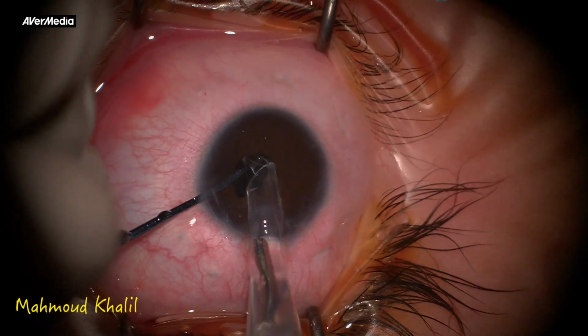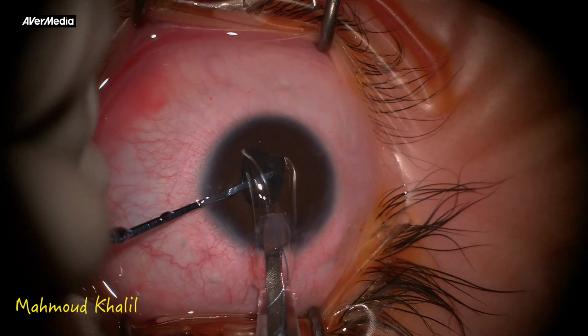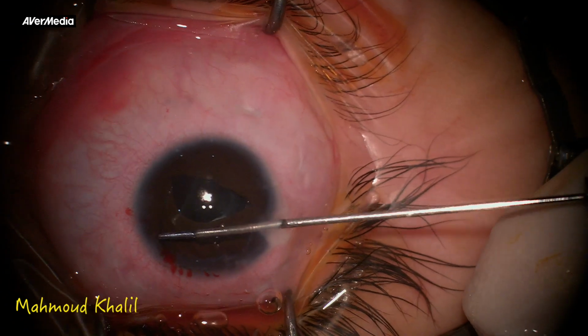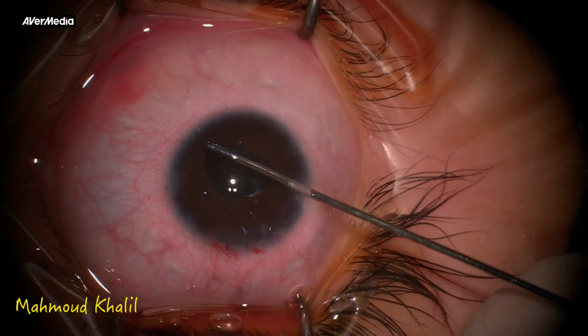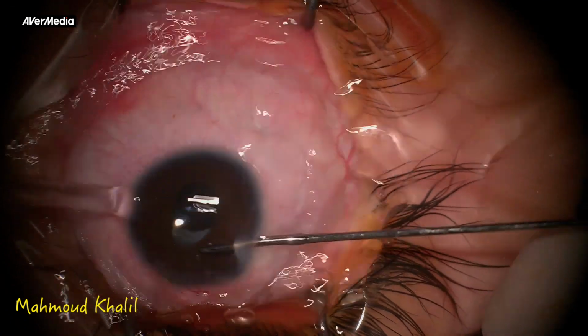Then going for another 3-piece IOL which was newly calculated, implanting this IOL inside the sulcus. The first haptic was engaged in between the iris and the rim, and then dialing the other trailing haptic inside the sulcus. And finally, this was the final refraction of the patient, and thank God it was plano with a visual acuity of 0.16.